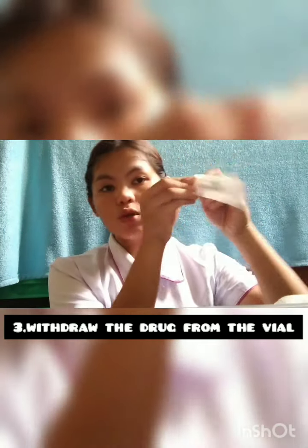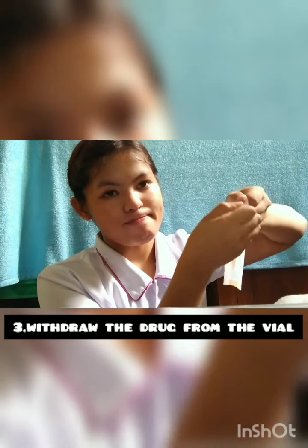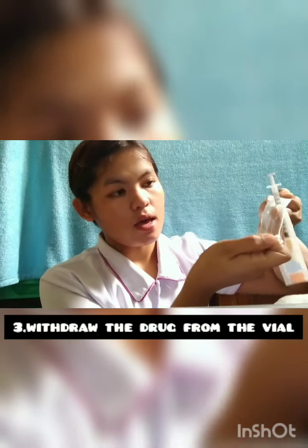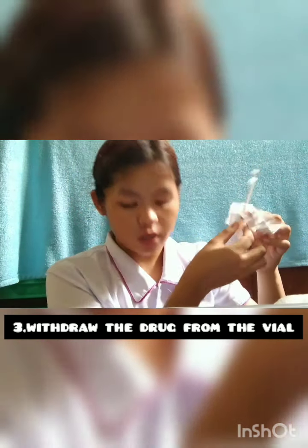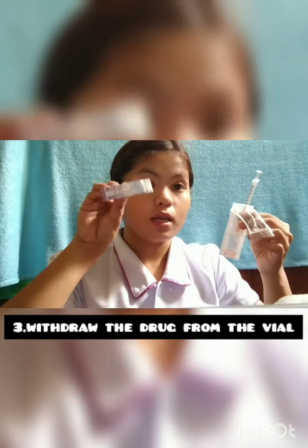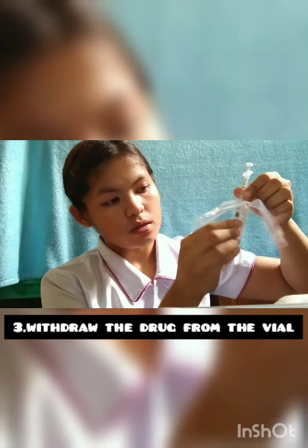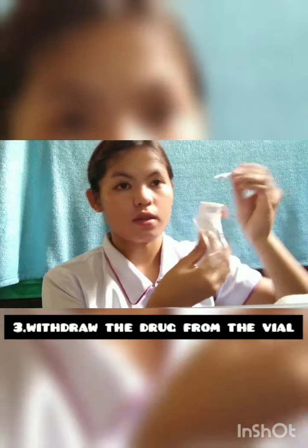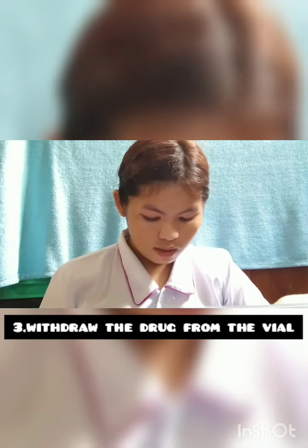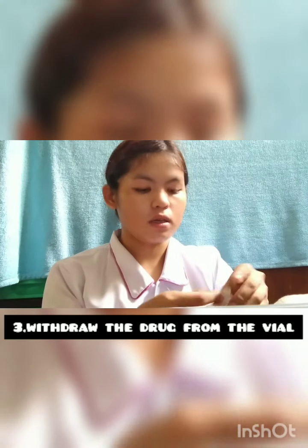We have to open it here like that, and we have to remove the needle because we are using the aspirating needle to aspirate the drug. There, and then make sure to not contaminate the needle.